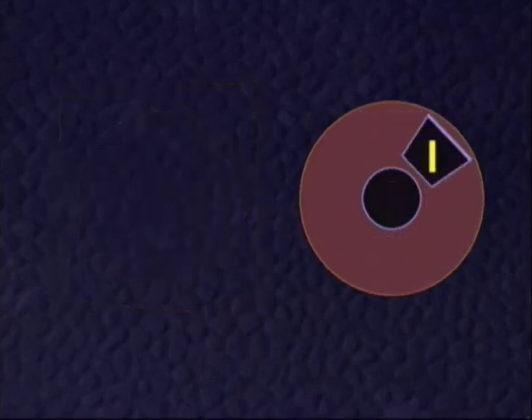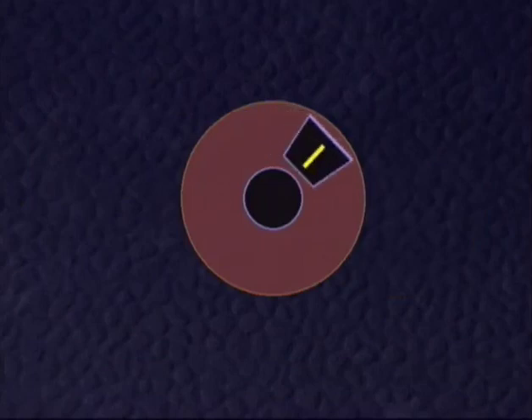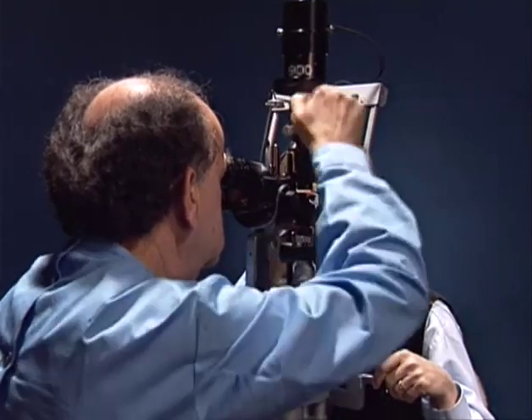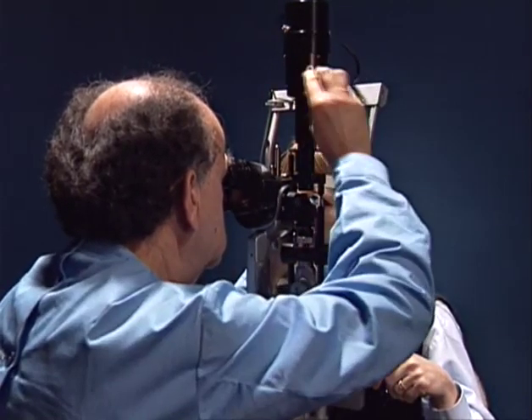If the examiner aims at an optical section in an oblique meridian, the mirrors are rotated and the optical knife is rotated as well, as always, combining the rotation with tilting of the slit beam. For an optical section in the horizontal meridian, again the rotation of the mirror must be combined with the rotation and tilting of the optical knife. This means that numerous manipulations for adjusting the slit lamp are necessary when rotating the optical knife. Therefore, the voluntary rotation is cumbersome and is reserved for special cases.